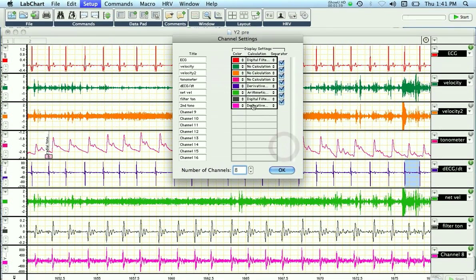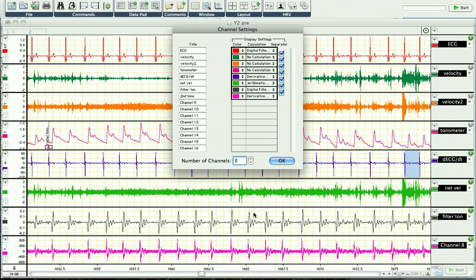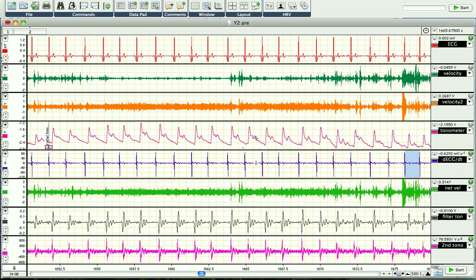So what that'll do is create 2 different channels, which you can already see here, but if you can't see these channels originally in your file, as soon as you do these steps they'll appear and you'll have the relevant information for those channels, and then we can subsequently calculate pulse wave velocity.